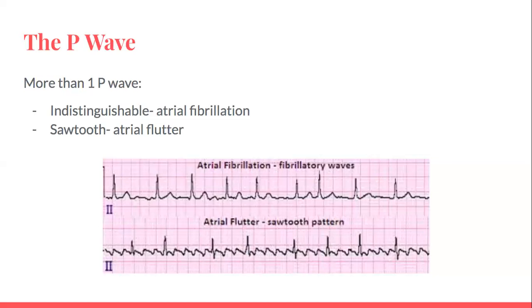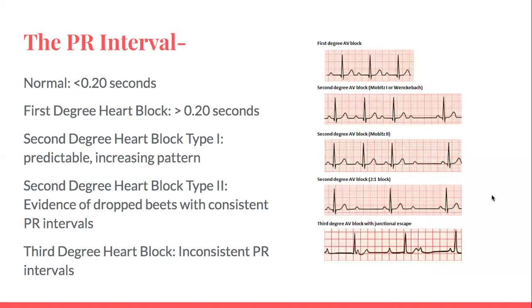It can require cardioversion, it can require arrhythmia medications. We're also going to be thinking about things like atrial fibrillation because that atrium is beating so quickly, it's actually just quivering and it's not having good contractions. So it's not having good blood flow to the ventricles. So there's increased risk of clots. So these individuals will also be having blood thinners as well. So these are both 2 rhythms that we do not want to see when we're looking at the P wave.